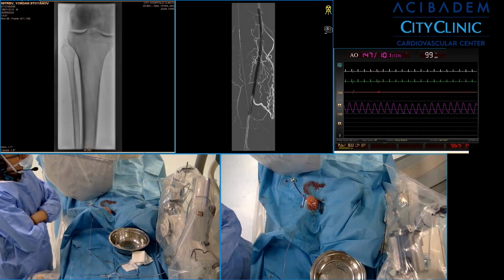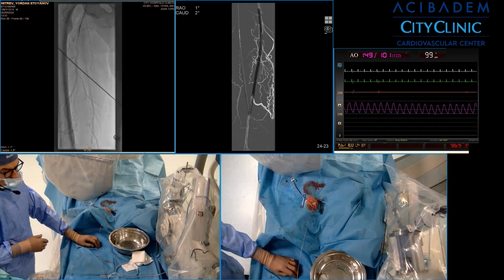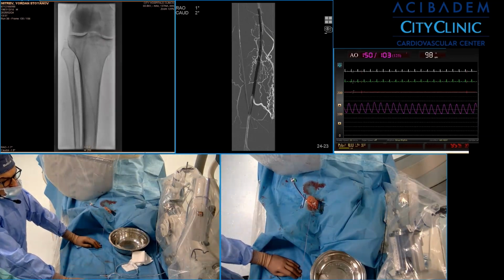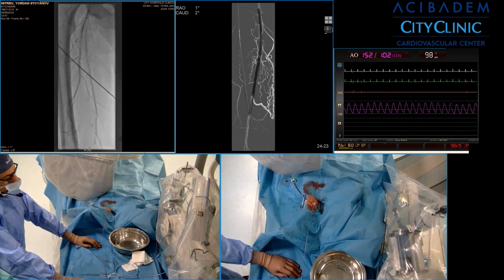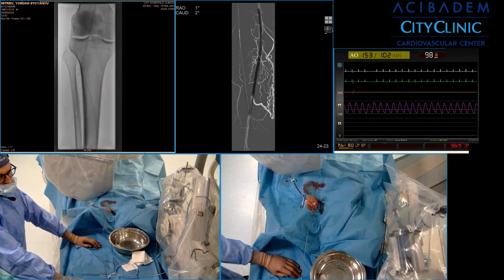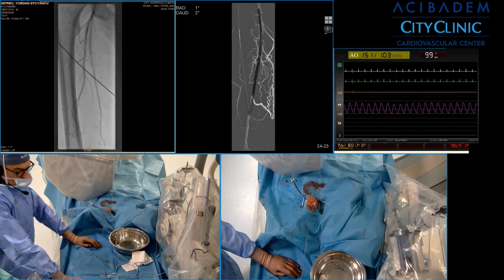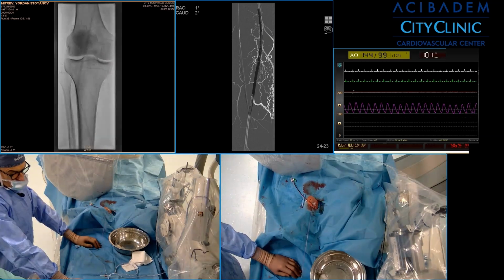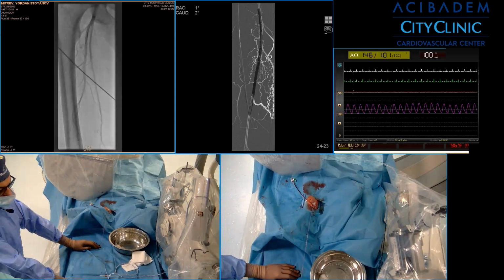Okay. What do you do for the pain? It's our general practice, since we are doing head-to-toe endovascular interventions, and many of them are not totally painless. We are practicing the so-called conscious sedation in most of the cases. So we give midazolam and fentanyl, in a conservative dose, in order to remove the pain, but to have contact with the patient if necessary.